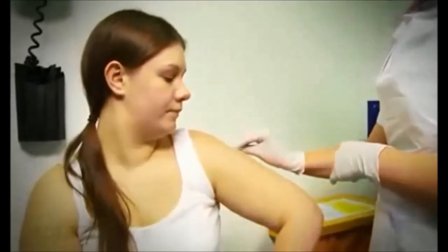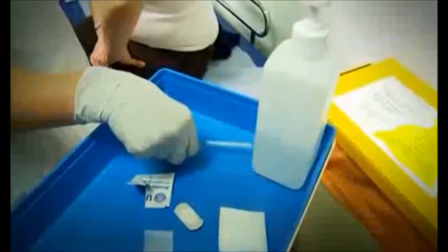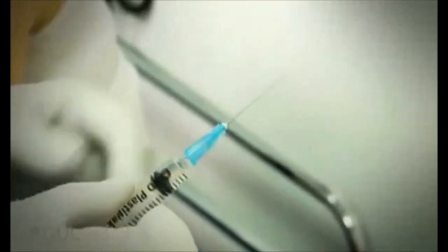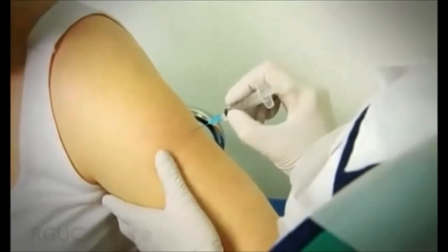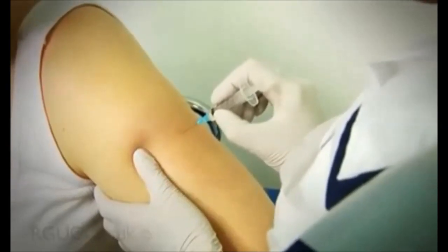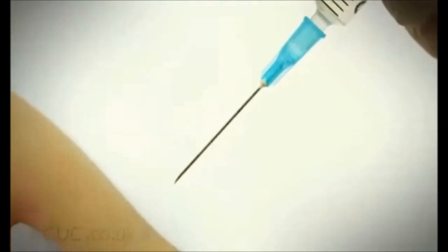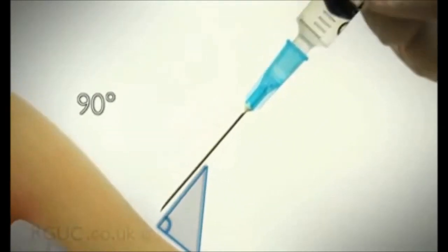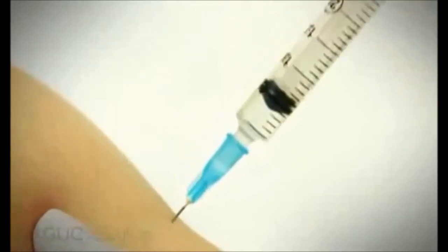Clean the intended injection site with an alcohol-based skin cleansing wipe and leave to dry for 30 seconds. Remove the sheath from the needle. Using your non-dominant hand, pull the skin away from the intended site, moving the cutaneous and subcutaneous tissue by approximately 1 to 2 centimeters. Hold the syringe in your dominant hand like a pen and insert the needle into the skin at a 90-degree angle, ensuring that 1/3 of the needle is left outside.